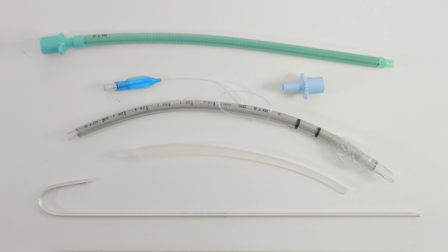The kit also includes flexible reinforced airway tubing with a fixed 15mm ISO connector, a connector to mate to an introducer, and a malleable stylet.